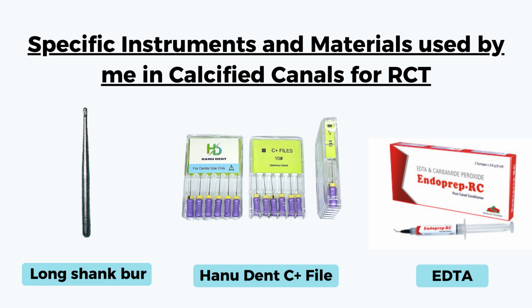These are the pictures of the instruments and materials that I have used in this case: a long shank burr with a small head from Mani, C+ files from Hanudent, and EDTA solution.